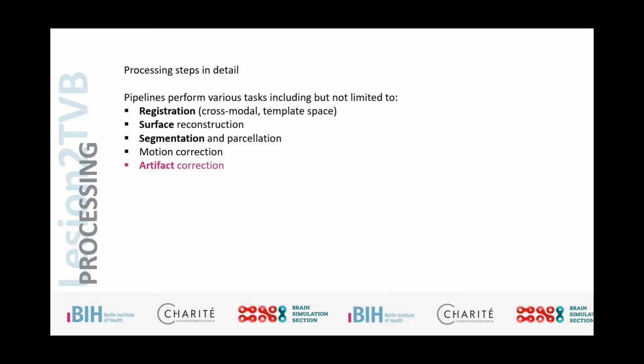We're talking, for example, about functional MRI, because now we don't just have a single 3D image being acquired, but we end up with a 4D time series. And if we are talking about task-specific data, the subject is in the scanner for a lot of time, and the resolutions become smaller and smaller, 2 millimeter, 1 millimeter, even in functional imaging. Even slight head movements have a lot of impact on the actual positioning of the brain and of the single voxel. So performing motion correction is a very important aspect. There are different techniques for this, and I won't go into too much detail.